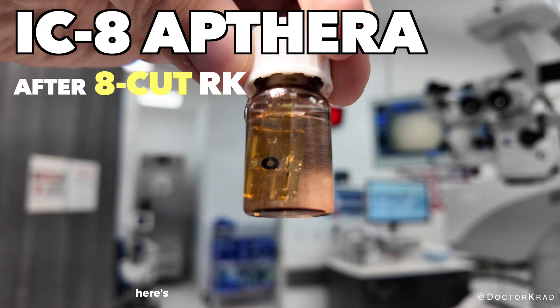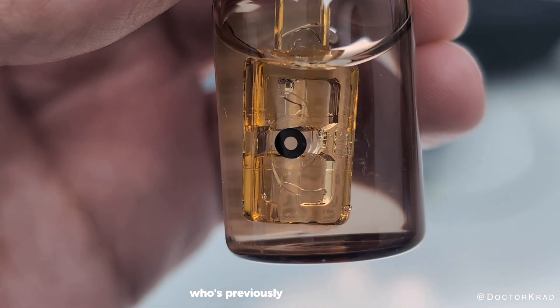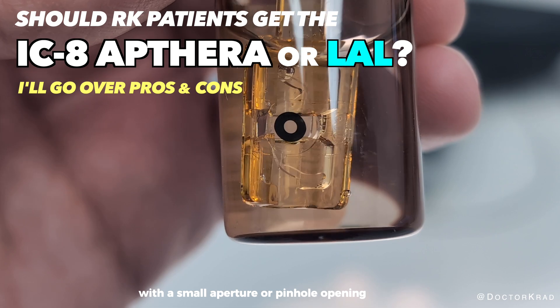Hi everyone, it's Dr. Krad. Here's a lens implant with a black ring in the middle. In this video, I will be implanting this lens for a patient who's previously had RK surgery. But what's the point of this black disc with a small aperture or pinhole opening within it?